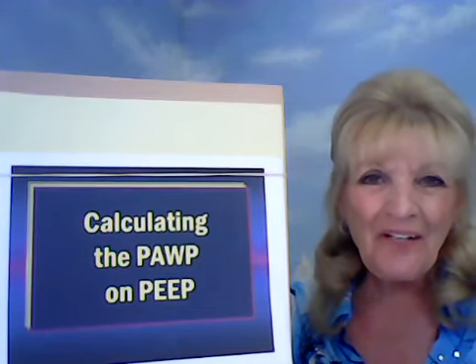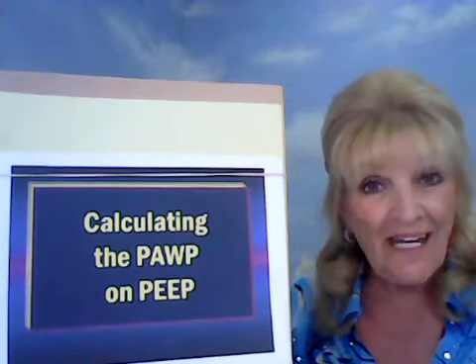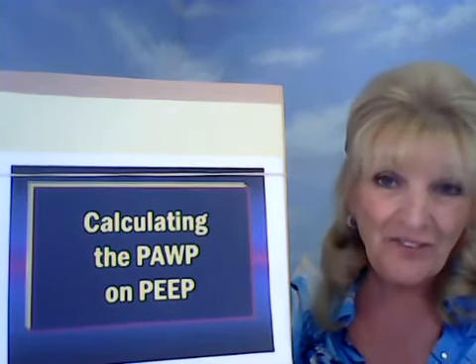Tonight's discussion will be on Swan-Ganz catheters, figuring out what the correct wedge is when someone's on a PEEP. And it has to be a PEEP greater than 10. Any PEEP less than 10 will not affect your wedge. So any PEEP greater than 10 will affect the wedge pressure that you get. And so the calculation that you could use in order to get the accurate wedge, and that's what we'll be doing. Let me see who's on here. So good, we got a few people on already.